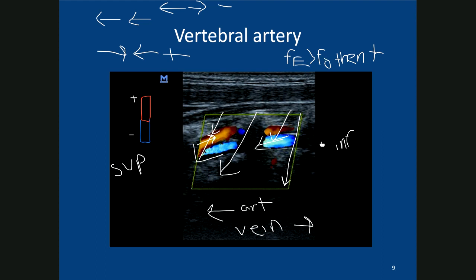So hopefully this is just a review and it's all coming back to you and you guys remember this. If not, you absolutely have to know how to read your color map and your Doppler display spectrum. Otherwise, you won't be able to perform accurate vascular scans.